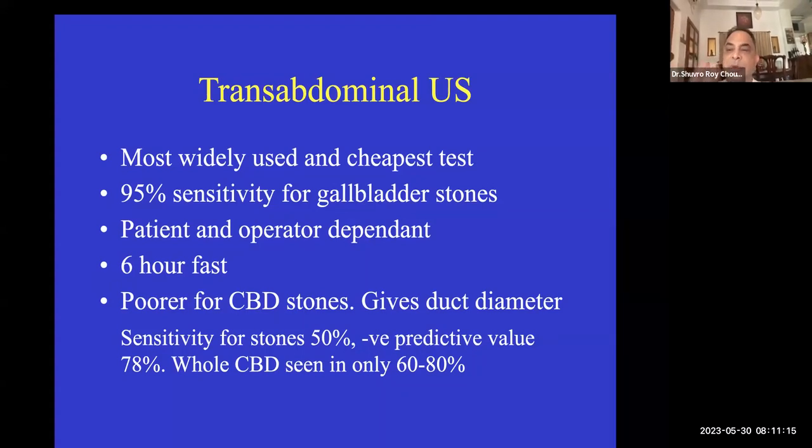Now, when it comes to MRI, even compared to MRI, ultrasound is a better test to detect a gallstone in a well-distended, 4 to 6 hour fasted gallbladder. The reason is simply this. Remember that MRI, by its very nature, like I talked to you previously, is not a great spatial resolution scan. MRI is a great contrast resolution scan. In other words, if you want to detect a tiny little structure, MRI, because the slice thickness is a little wider, may miss a tiny little stone, particularly on standard MRI.